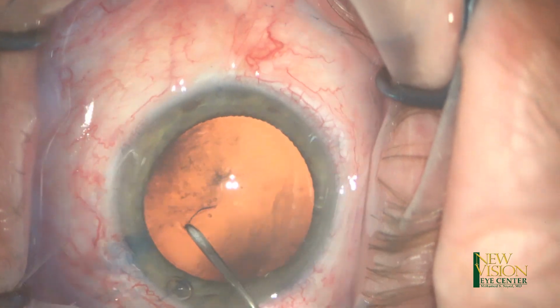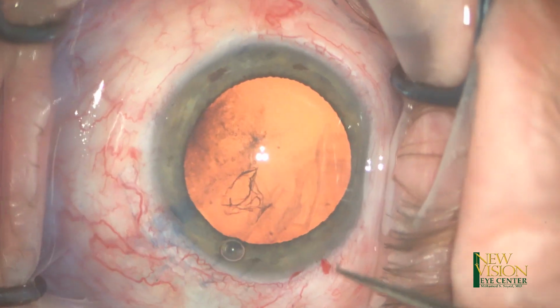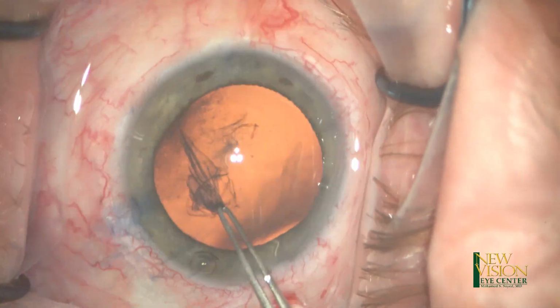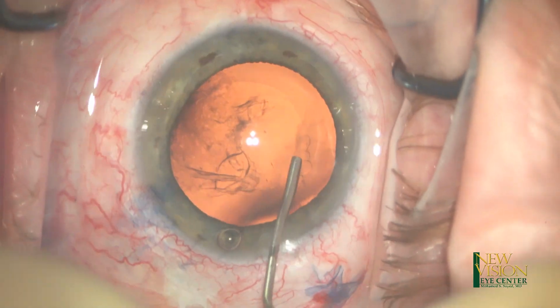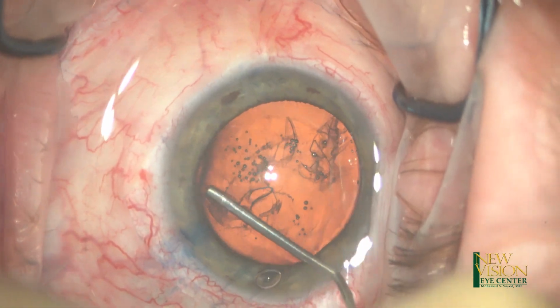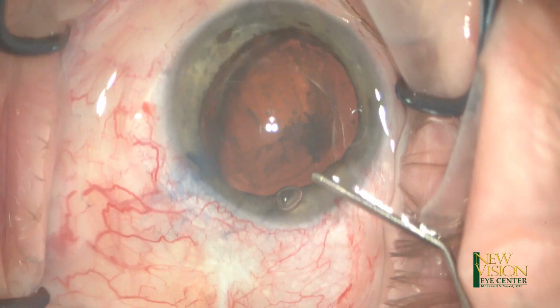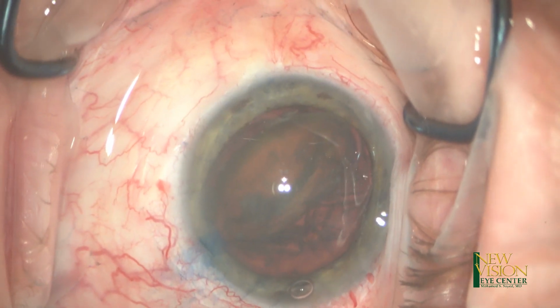I did not really feel there was any inferior zonular weakness while creating the capsulorhexis. I then proceed to completing the capsulorhexis with utrata forceps, about 5 to 5.5 millimeters in diameter. It was slightly inferiorly decentered, but it was okay. I then do a hydrodissection, and I really wanted to prolapse the nucleus out of the capsular bag just to be sure that I don't exert any undue stress on the zonules.